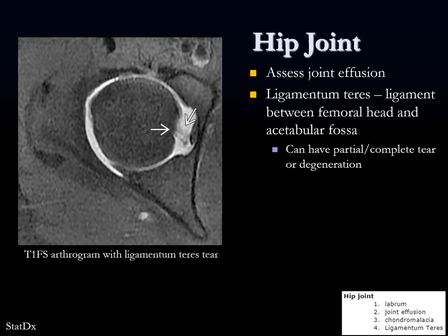The ligamentum teres is the ligament between the femoral head and the acetabular fossa. It can be torn or degenerated - a pretty uncommon finding, but it can be symptomatic. Look at the ligamentum teres to make sure it's normal - typically it would just appear as a dark black structure.